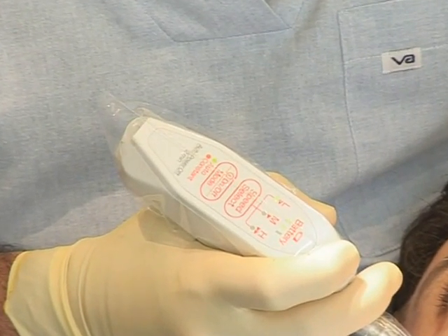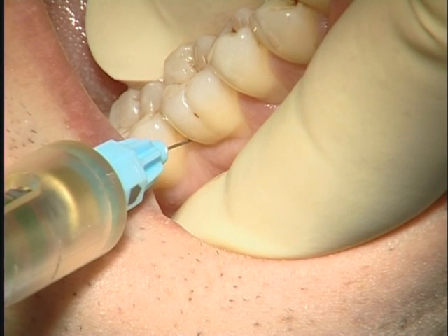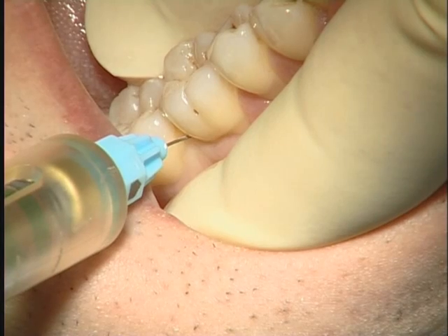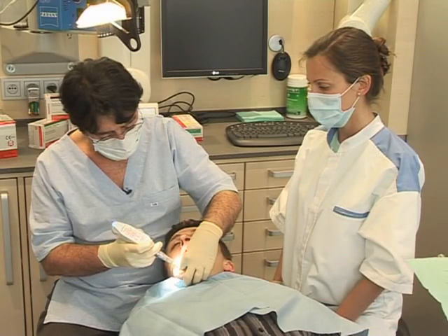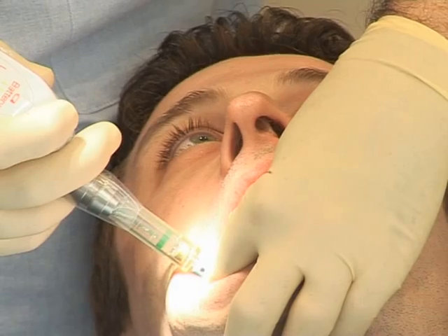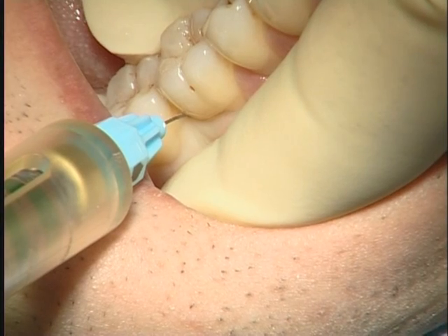Using an Anaject automatic electronic injector is more comfortable for both the patient and the dentist, as it does not require the firm pressure on the syringe piston that a mechanical syringe does. The dentist can concentrate completely on the point of impact and avoid blocking of the needle in the sulcus, as the solution is delivered automatically at a controlled speed.